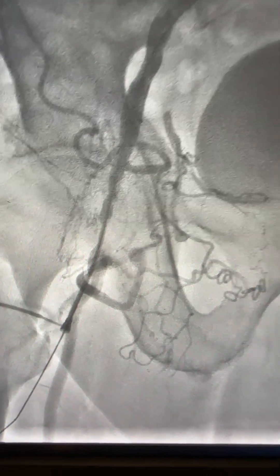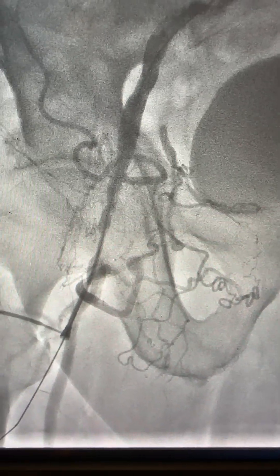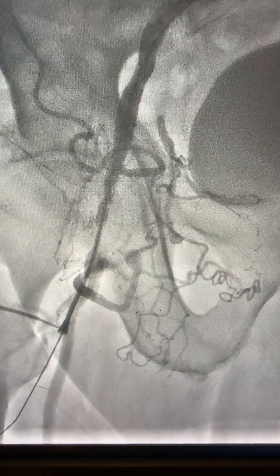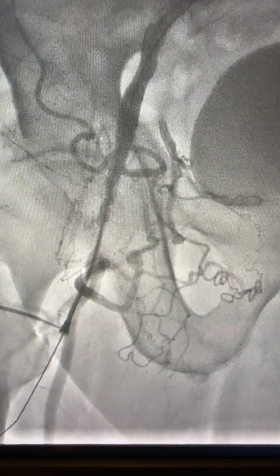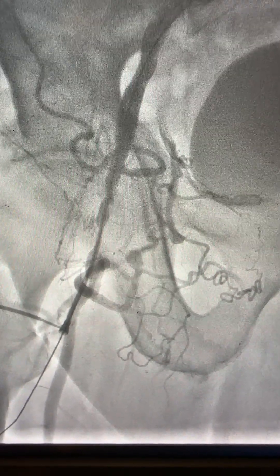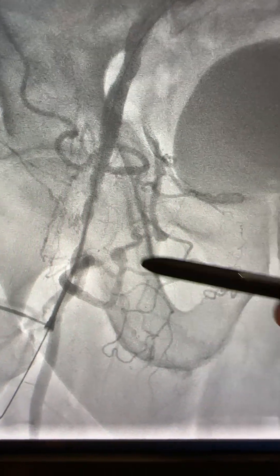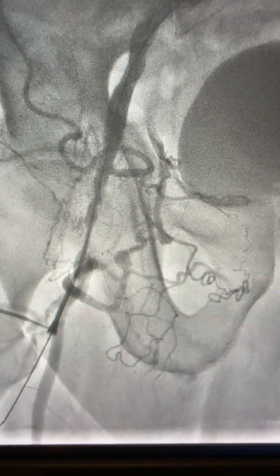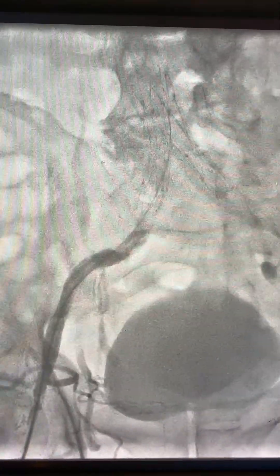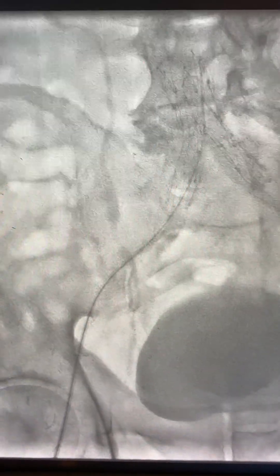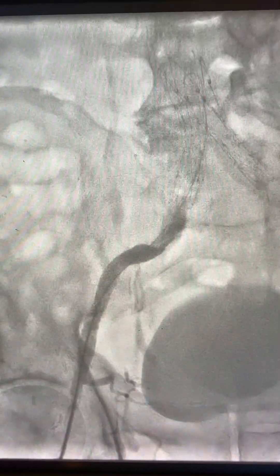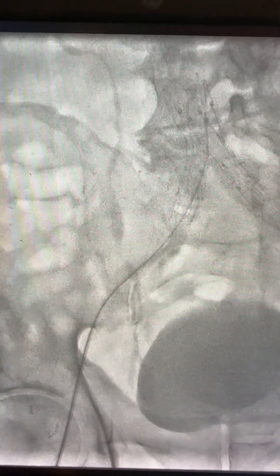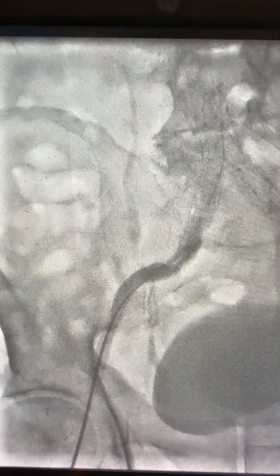Hi, this is Dr. Hamill. I would like to share with you this case of peripheral occlusive common femoral artery after doing the heart catheterization. You can see the lesion and the occlusion with the sheath. The patient has multivessel CAD and peripheral disease, with stents in the iliacs and aorta.